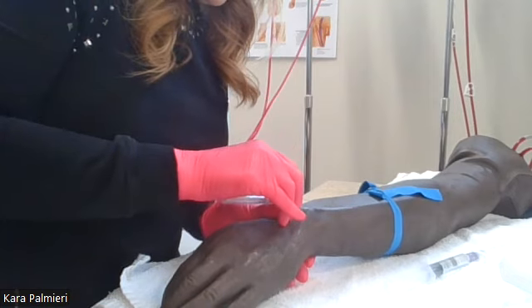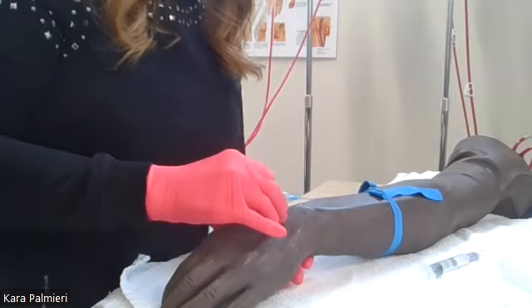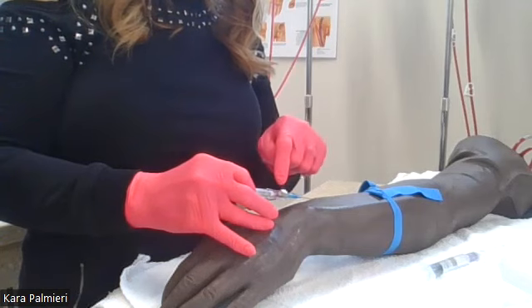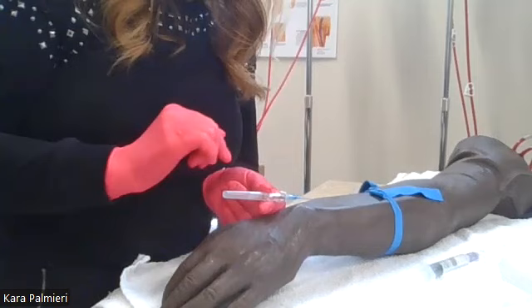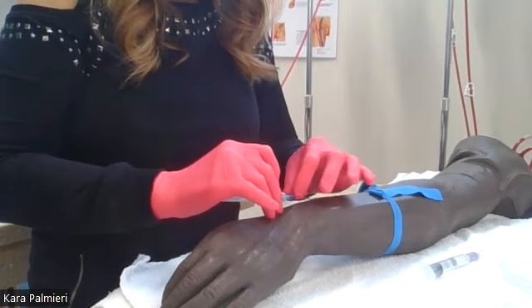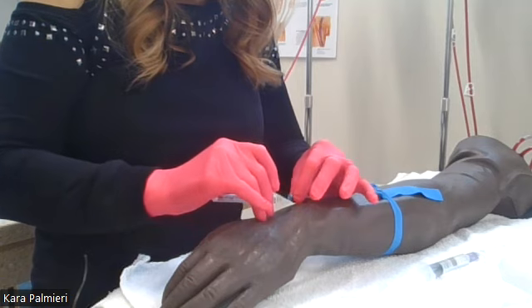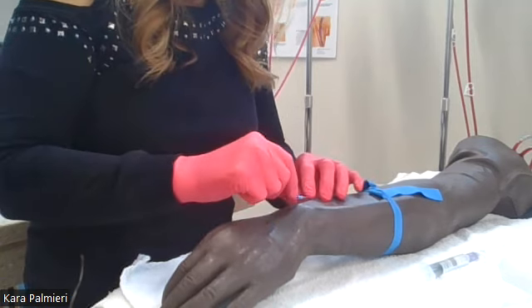And as I'm pushing this in, I already have a flash. I can see it coming back in here. I doubt that you can see it, but I can see a little bit of blood right here. So I'm not going to push this in any farther yet, because if I do that, I'm going to go right out the other side of the vein. So I'm going to stabilize this, and I'm going to push in with the blue and push, and it's leaking very good. I should have went a little farther.